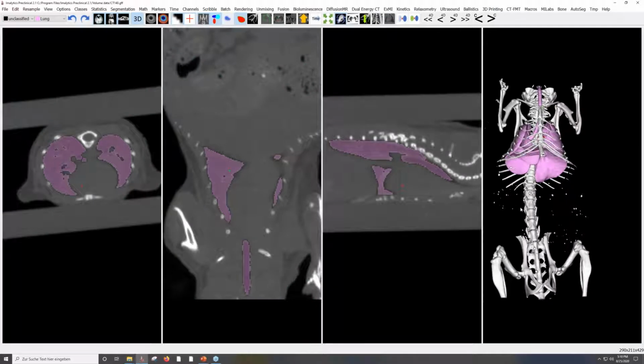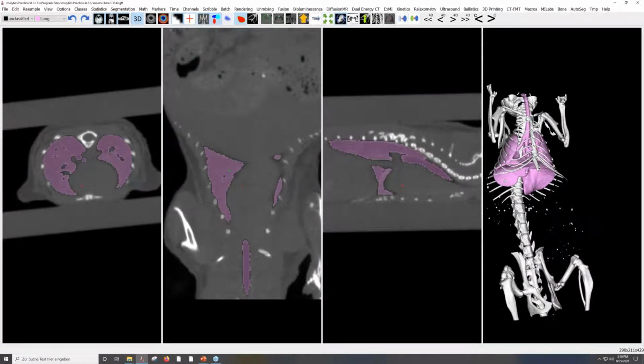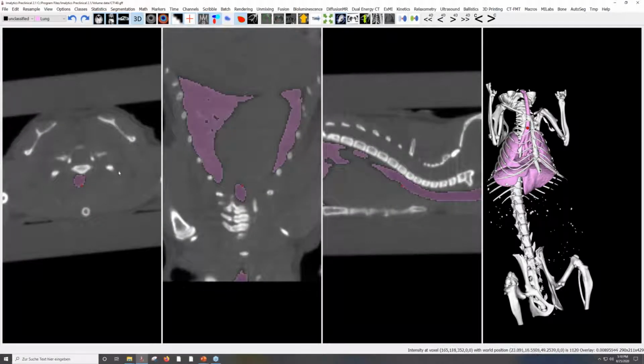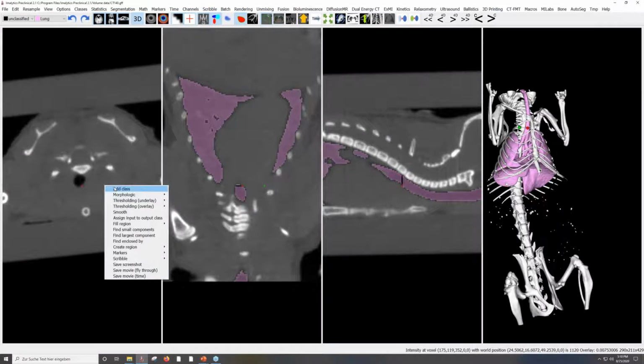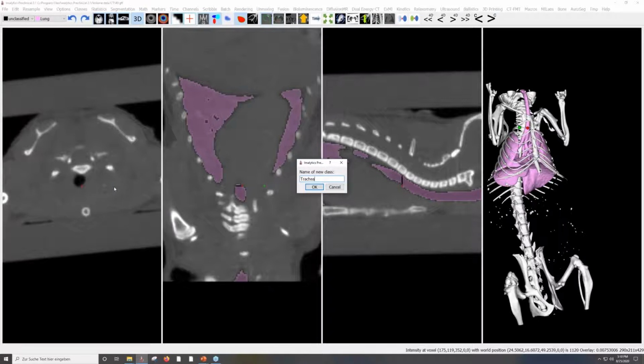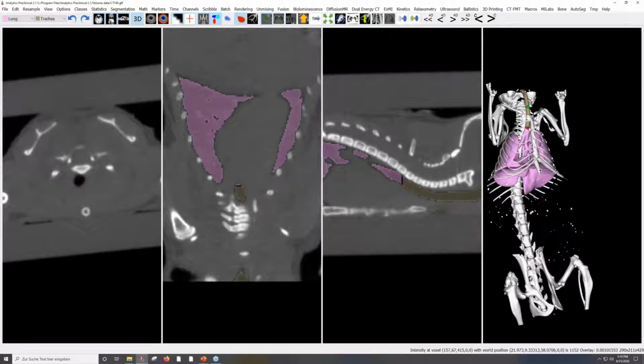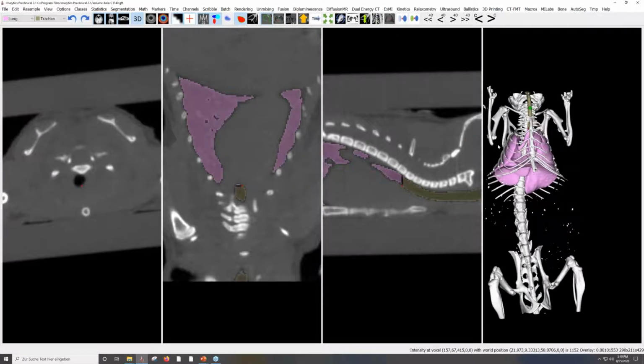And we have the lung in 3D. And let's cut off the trachea because it doesn't belong to the lung. So I'm just jumping somewhere to the slice views. Now I'm using the scribbles and drawing a scribble here and then press F2, that's for a quick cut. And now I can add another class, trachea, and fetch the trachea with the free region operation, and it'll just flow until we reach the cut here.